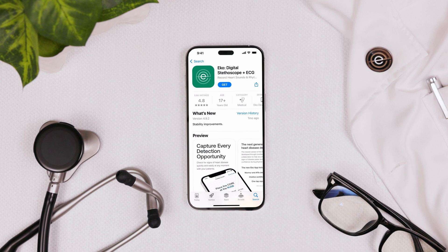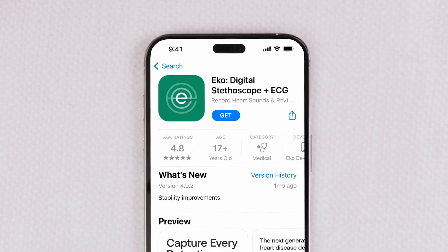First, let's download the app. You can get the app on iOS and Android devices. Download it for free in the Apple App Store or the Google Play Store.